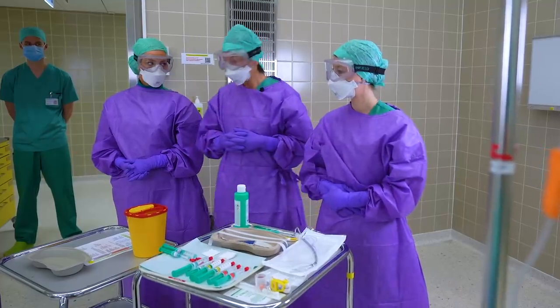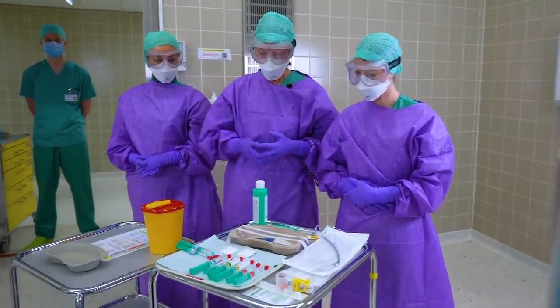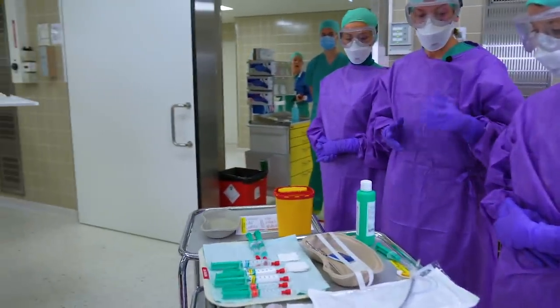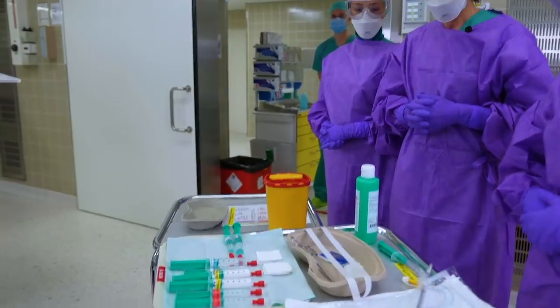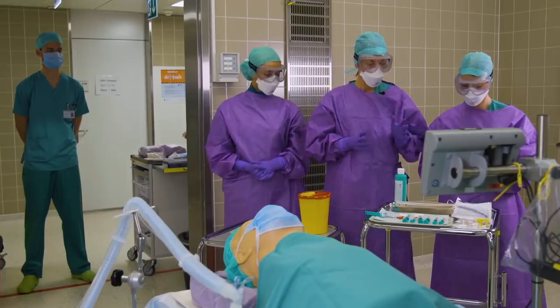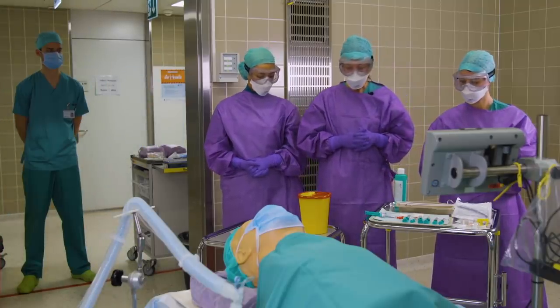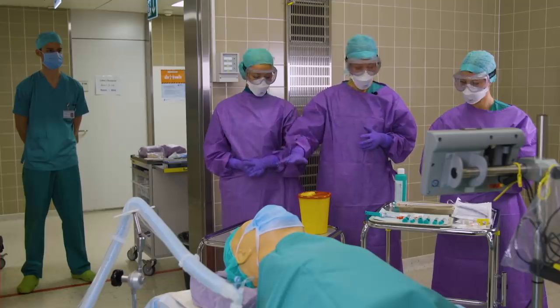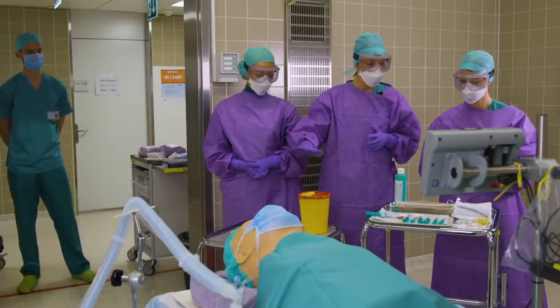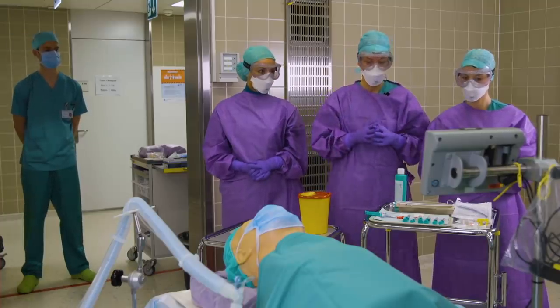For induction, we have our medications on the tray, as well as our airway materials, including an endotracheal tube with a stylet in place, as well as our video laryngoscope. Next to the induction table, we have our dirty tray for dirty materials to be disposed there.